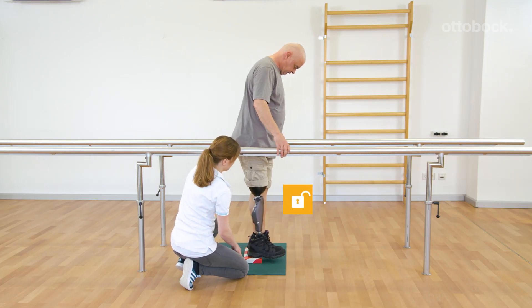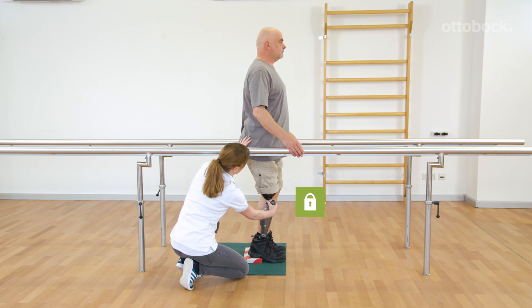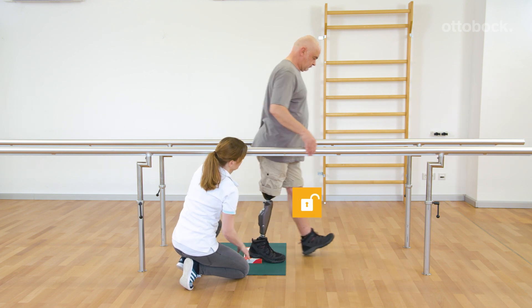When the first step is taken by the contralateral side, there are two possibilities. If the prosthetic knee is extended, stance release will be triggered.